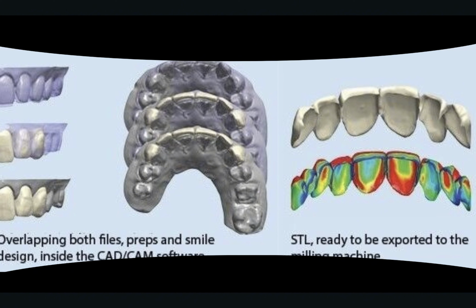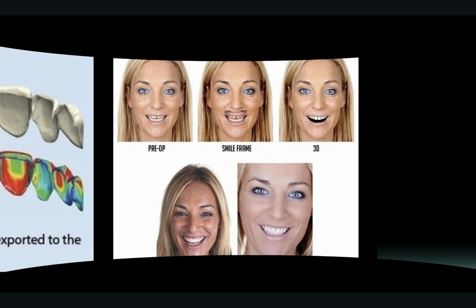More and more data being added, developed, revolutionized, where all of these things converged to be able to have this digital workflow where we changed 2D or 3D into 2D, back to 3D, and do it in a way that's reproducible and predictable.